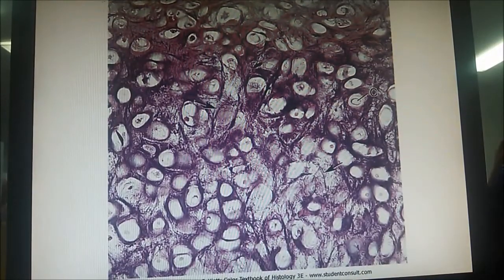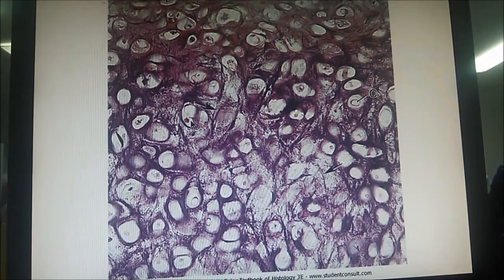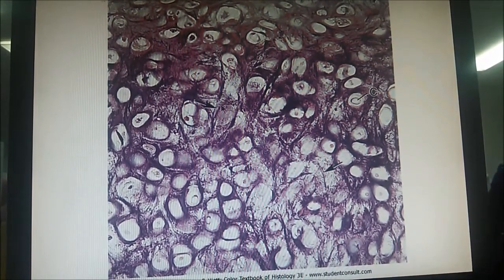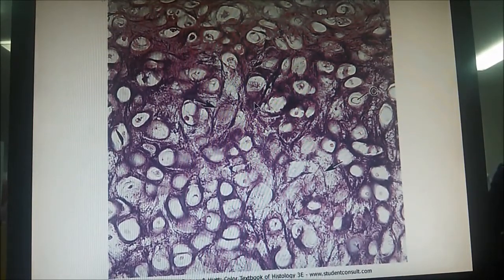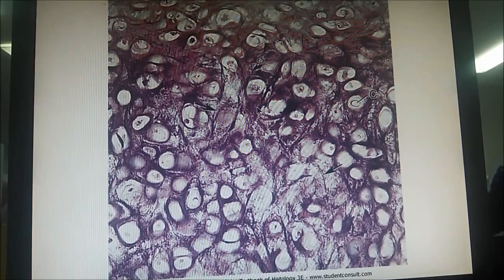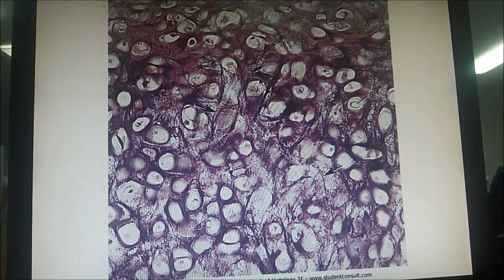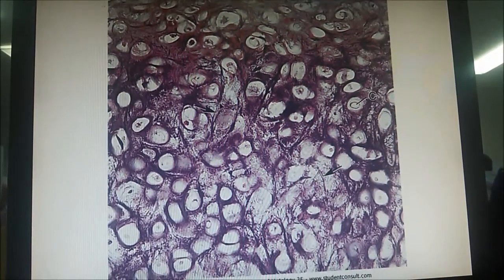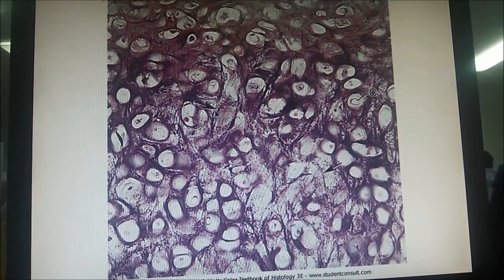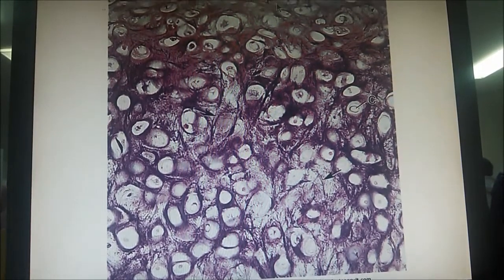Here, okay, zoom عالي. Chondrocytes, cells with rounded nuclei appears بقية السيتوبلازم whitish. بنطلع على الماتريكس ها شو دارك ماتريكس ولا لايت ماتريكس؟ دارك وفيها فايبرز. شو يعني هذا الكارتلج؟ هايلاين ولا elastic؟ Elastic. This is an elastic cartilage. You can identify dark fibers, elastic fibers. يعني الارو هون مؤشر على واحد من elastic fibers. حرف البي what does it mean? Stands for what؟ شو هون في؟ البيريكوندريوم طبعا clearly.